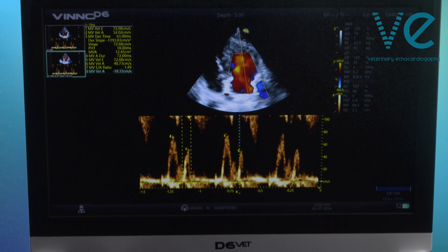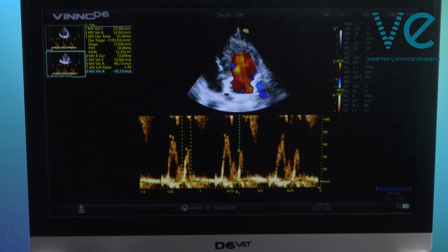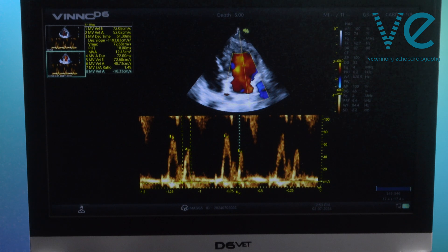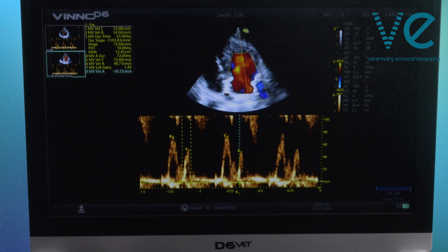Along with my 2D imaging, I'd want to be looking at tissue Doppler as well and making sure that confirmed my findings of the mitral inflow pattern.